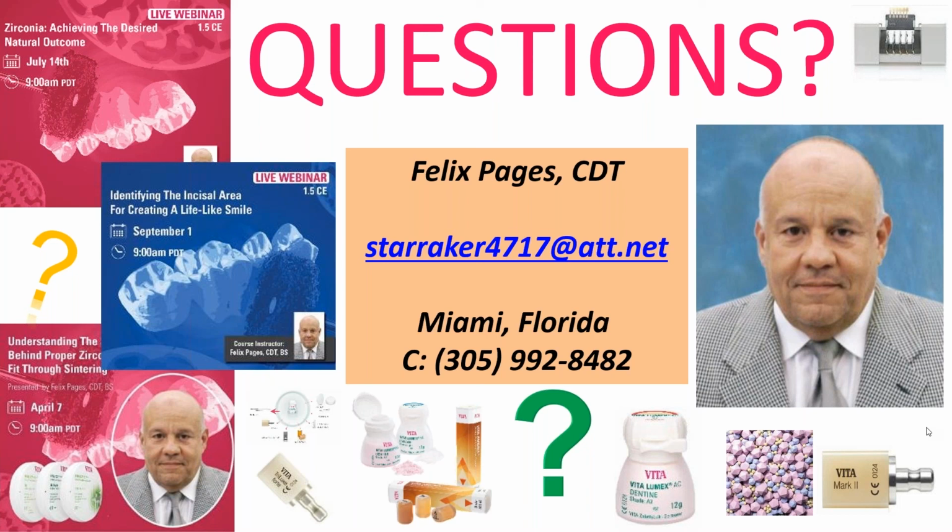It might get close to being pink, but I just don't see it. You have to have a white zirconia where you don't color there. And I can see pink on top of white that would look more like tissue. But still, the thickness isn't enough to make it look like a real one.